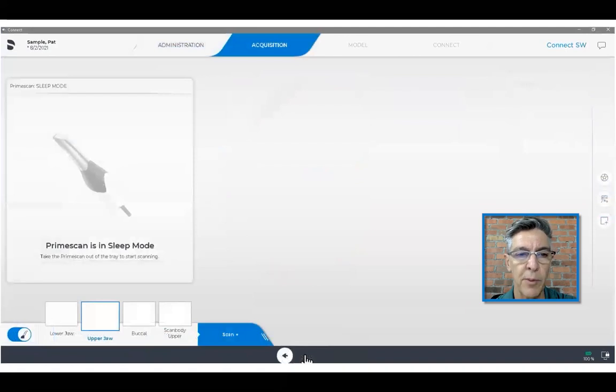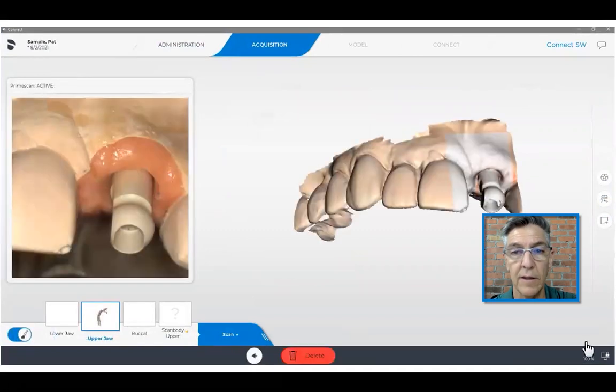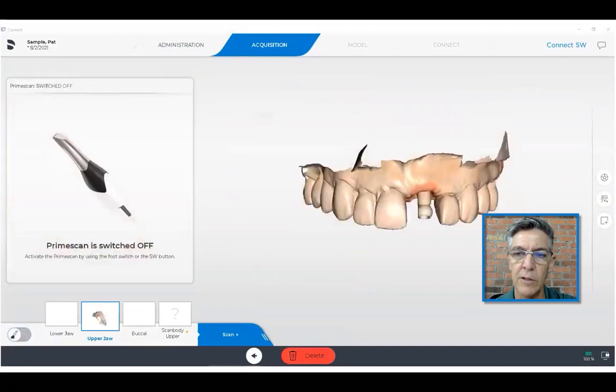So we move on and we scan our patient. We scan, of course, the upper jaw because that's where we've selected the implants. I'm just scanning a model for demonstration purposes. It's important that you scan the scan body completely.